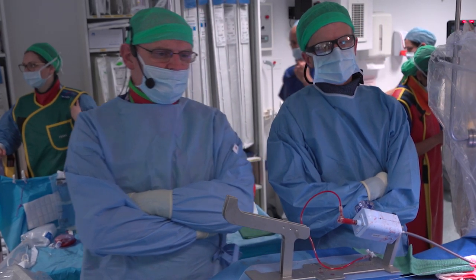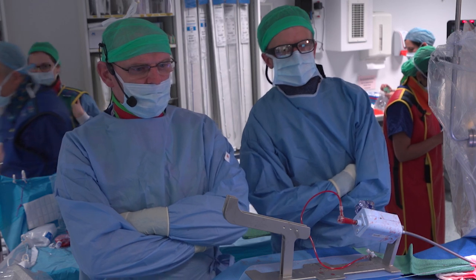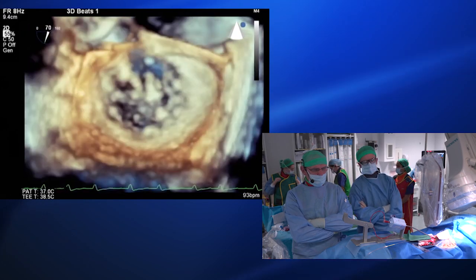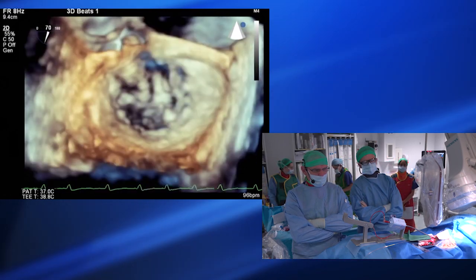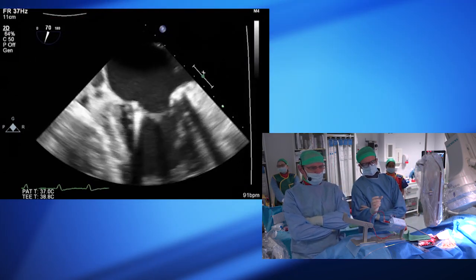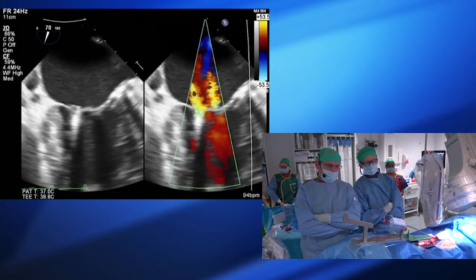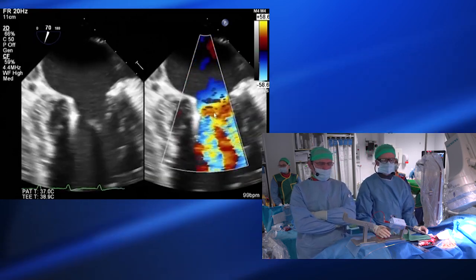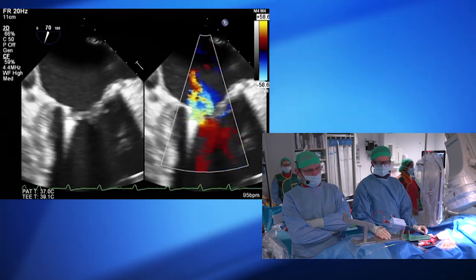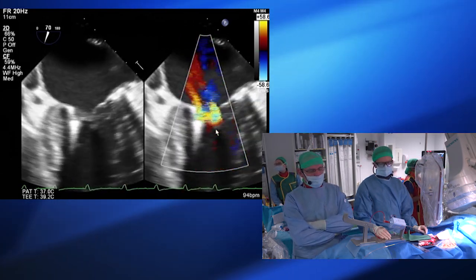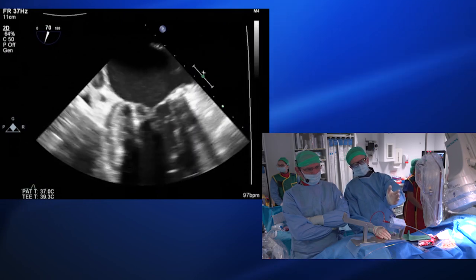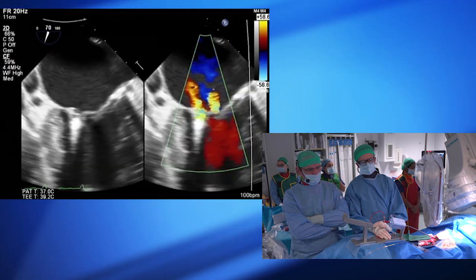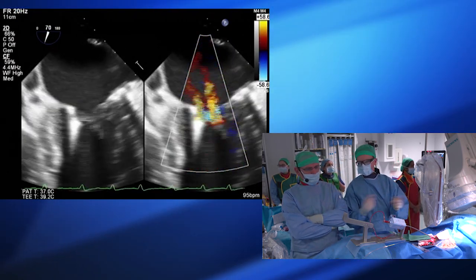Just thinking through our strategy for the next clip. We've already had a big impact on his MR — he will feel better from this, but I think we can do better. He has two residual jets, both lateral to the first clip, with a gap between them. The most lateral jet is the worst one. I don't want to put the clips too far apart because that might have a negative impact on the gradient and could cause mitral stenosis. So I think I'll aim just at the lateral side of that medial jet, and hope that the XTR with the longer clip arms will pull everything together sufficiently to handle both jets.